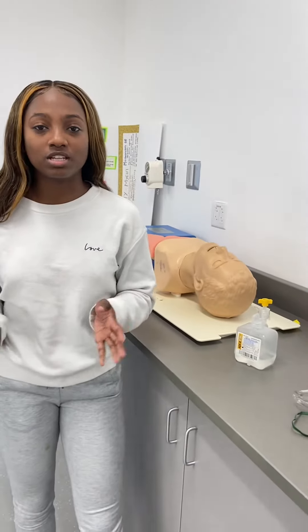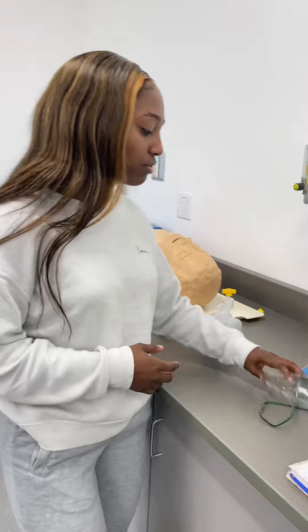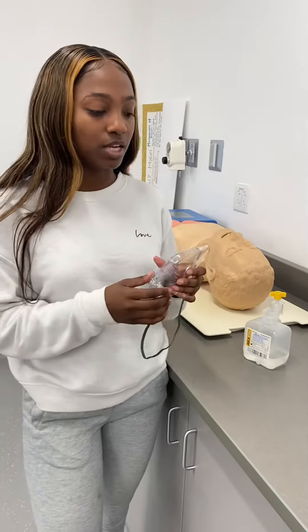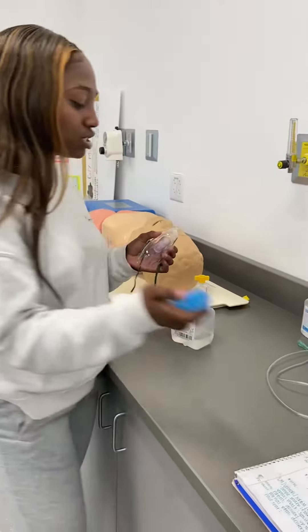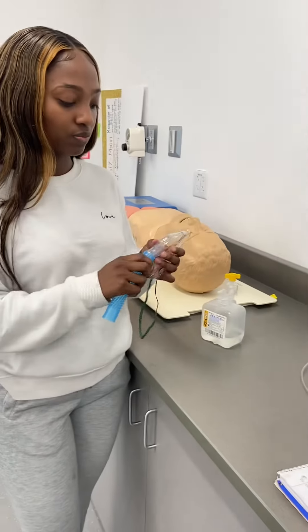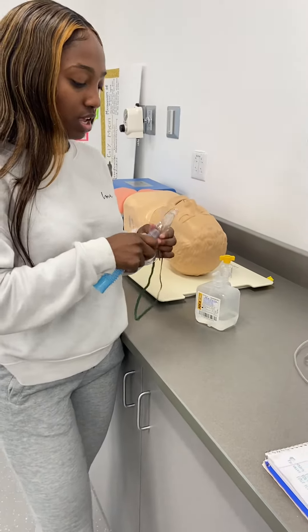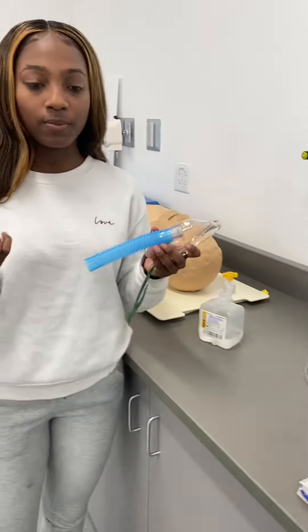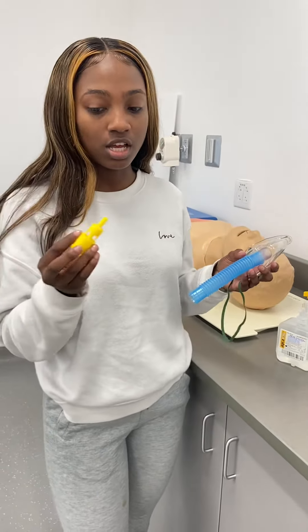Today I'm going to be demonstrating how to administer the air entrainment mask. First, you would use this mask, which looks a lot like the mask you would use for nebulizers. Then you would connect this tube, and at the end of this you would connect an adapter. This allows you to give the patient precise oxygen.